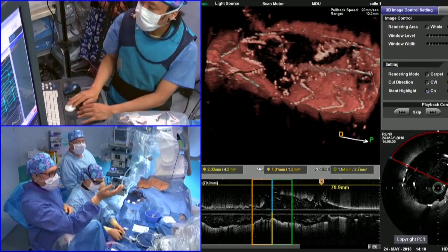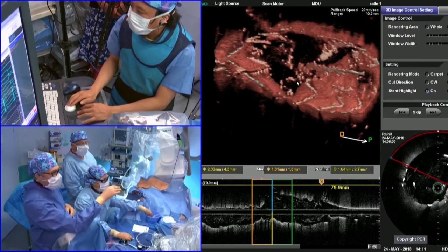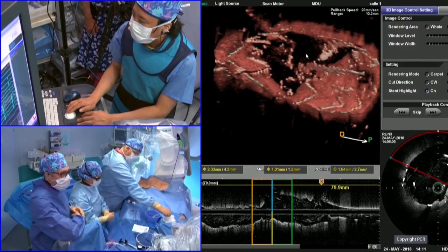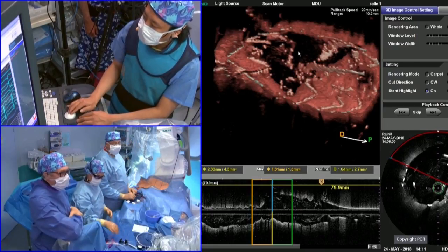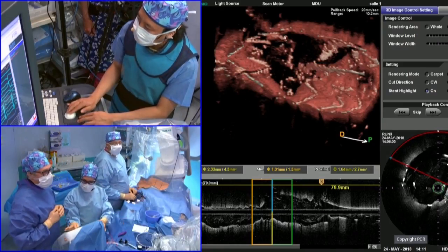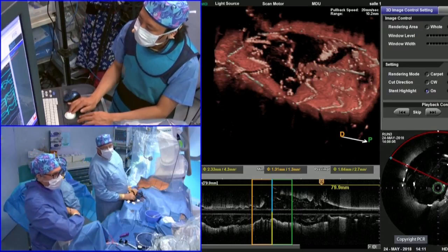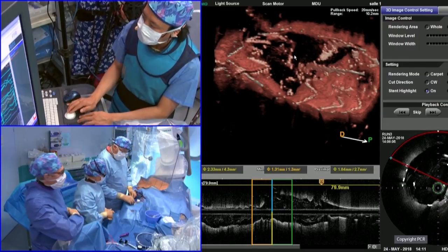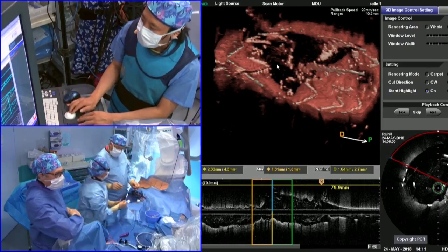So Goran, you can already see that we have the two diameters of the stent, LAD on the left and left main on the right. So the struts are already enlarged by the POT. Yes. Now, Yoshi, you will tell us in which strut we are. So I think we are taking the second distal strut. You can see that this is the carina. This is the ring of the strut. You can see that another ring is distal to this wire. So we should aim at this distal cell instead of the one which this wire is now taking. This is the second distal cell, so we should really go one beyond so that we can really expand well.